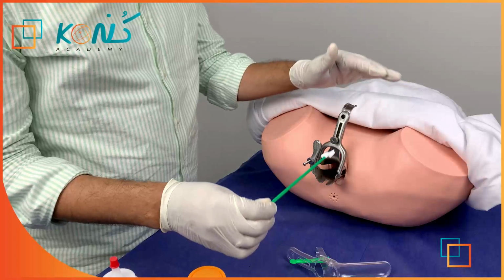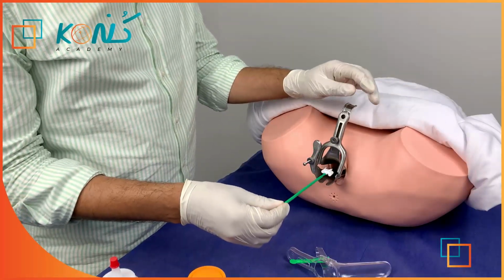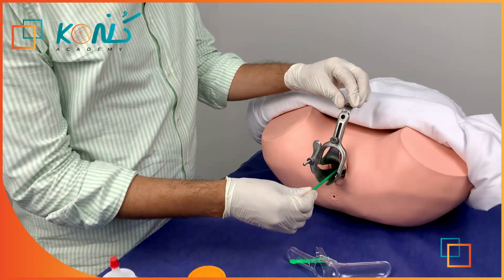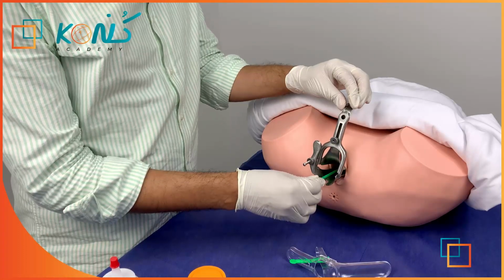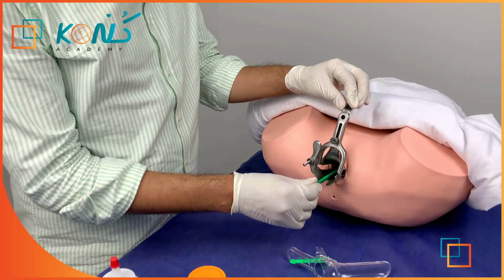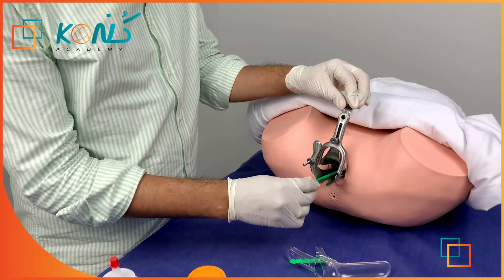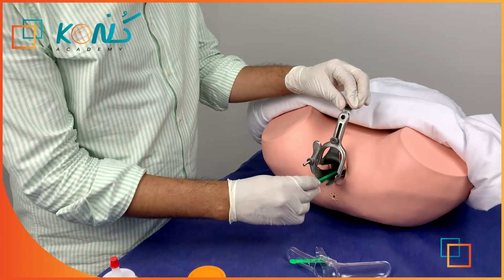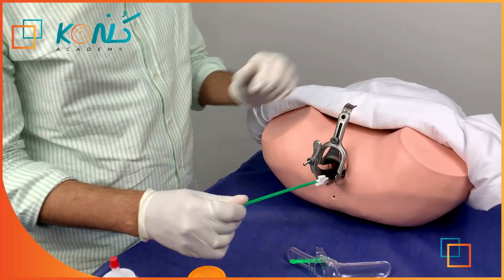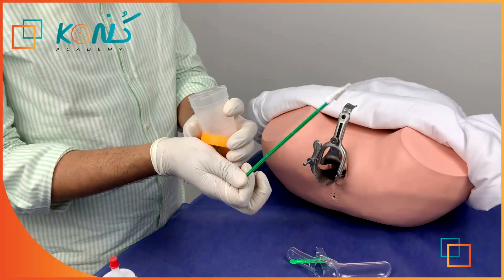How to put this brush to get your sample? We are putting this brush like this. Mrs., we are about right now to put the brush to get the sample. We are letting our patient know what we are doing, and we are putting the brush like this. The ideal way to get your sample is to rotate this brush 5 times, 360 degrees. 1, 2, 3, 4, 5. Then you will take the brush out. Right now I have finished taking the sample, Mrs. And you will put it in this liquid-based container.